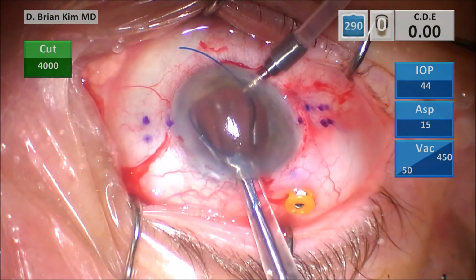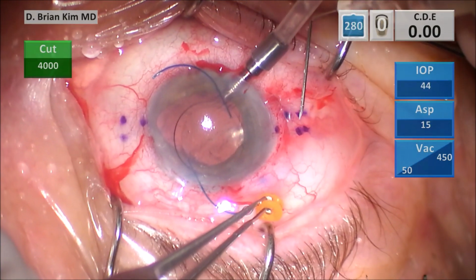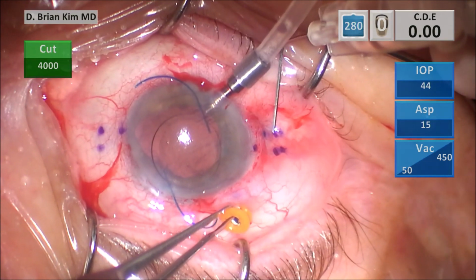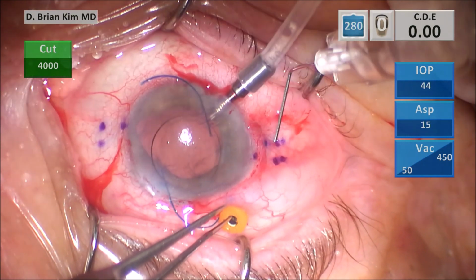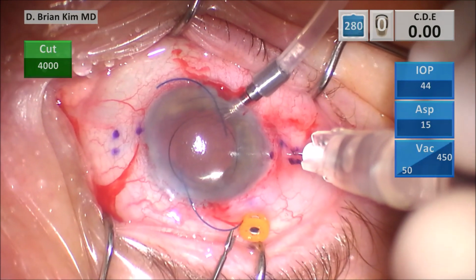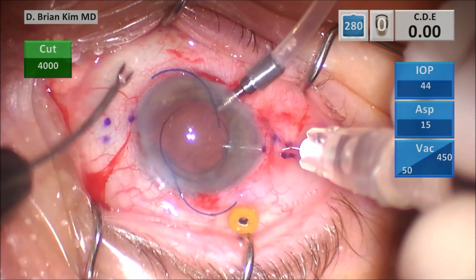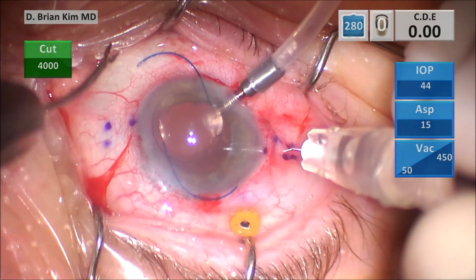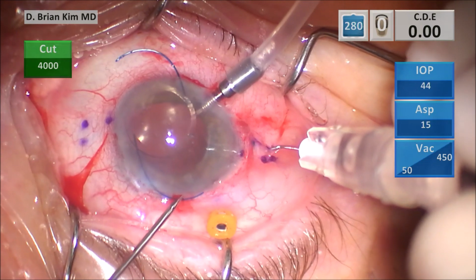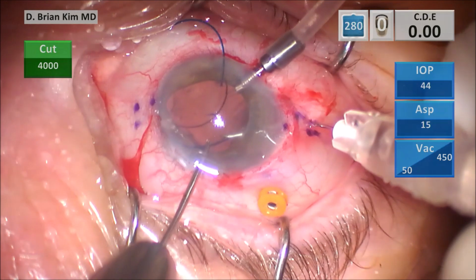I go ahead and advance the optic and then make sure the trailing haptic comes out pointed to the right. I'm holding the trocar to keep the eye in the neutral position. You can see how my needle is bent, and I'm tunneling and then diving in to the second mark, making sure the eye is in the neutral position so that the scleral needle placement reflects where I want it to be placed. When you see that the trailing haptic is too pushed out, you can see I just pulled the leading haptic more out and I was able to have a better exposure. You can see how easy the exposure is by doing it this way.